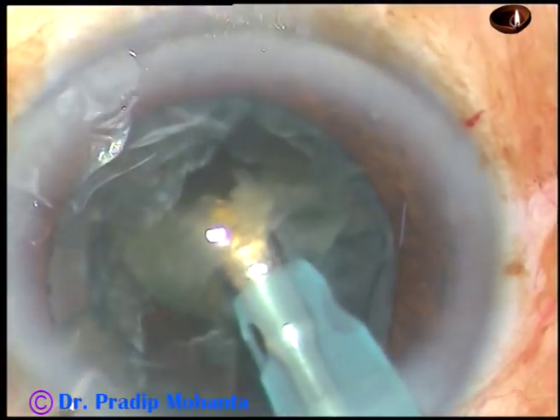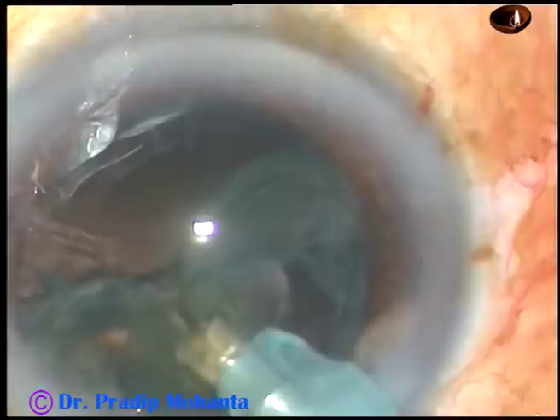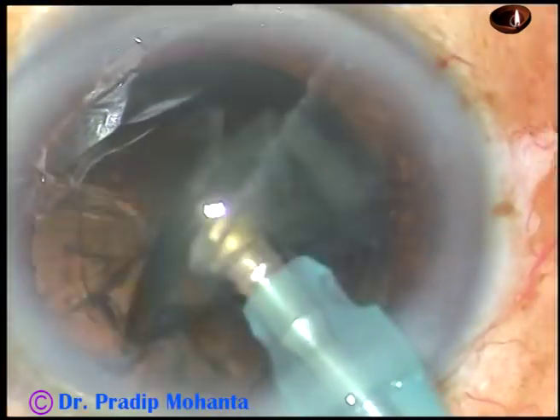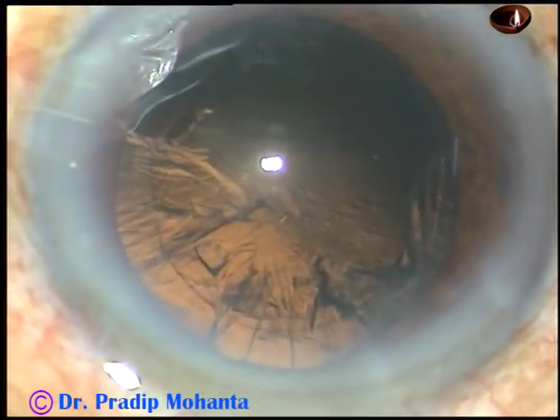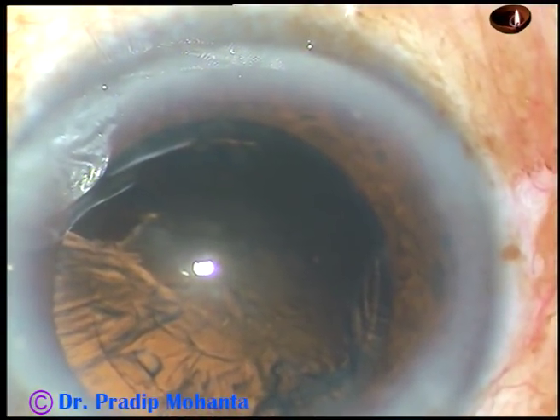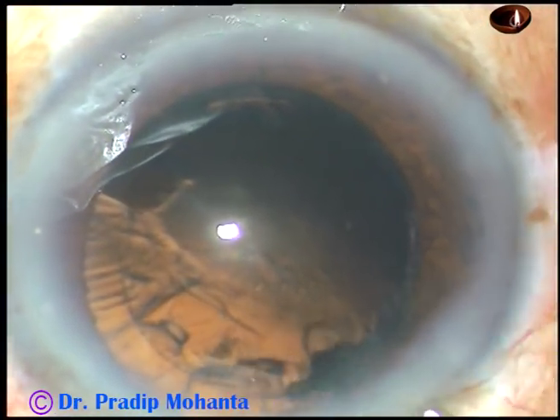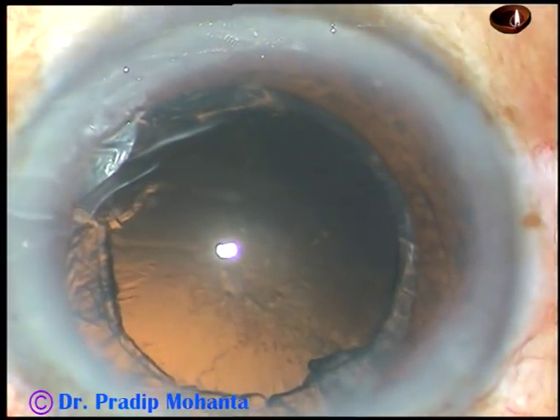This is a totally unedited surgery and you can follow this very well, I believe. The epinucleus has been removed. And now inject viscoelastic substance and remove the cortical matter.